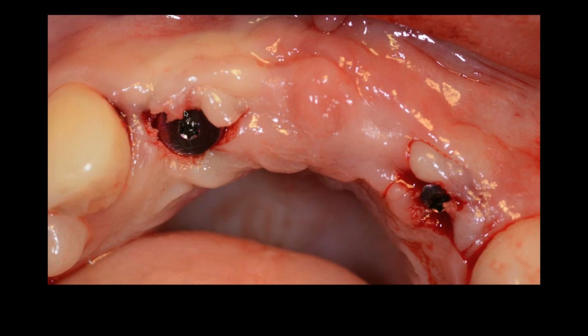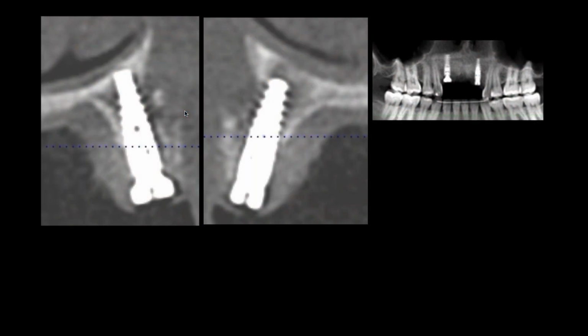All of a sudden, we're really doing well as far as being able to bulk that tissue up, because my goal is to get rid of the pink. I have no pink on it. And we're getting pretty close. So you can see the images here, very precision placed. It's very important to precisely place the implants exactly where they need to go. The only way I knew where to go was the digital imaging of the setup, which was easy. That's a no-brainer. And I don't have to spend a lot of time on it.